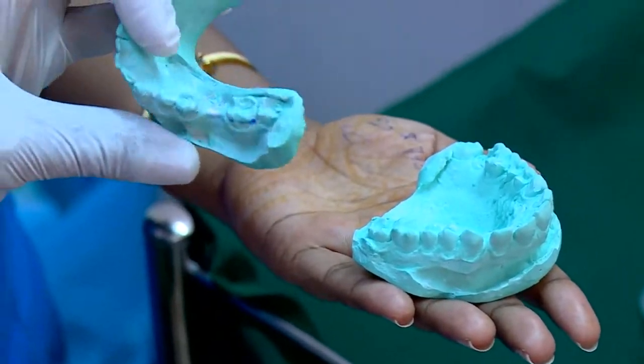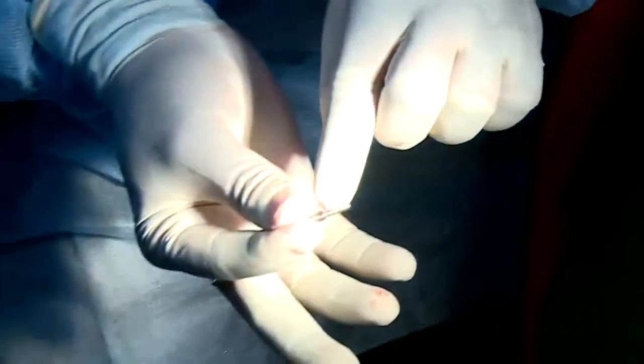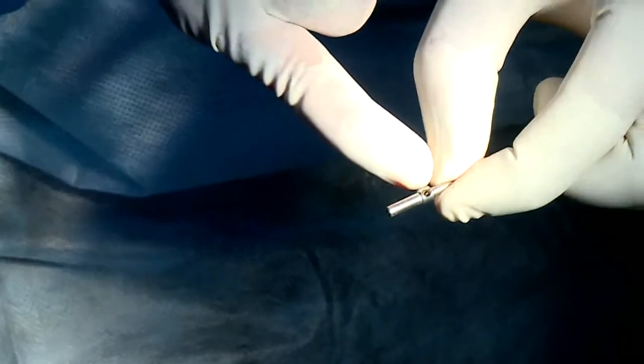Now, I placed this paralleling pin. This part went inside the osteotomy socket. Now you can see that there is a hole.